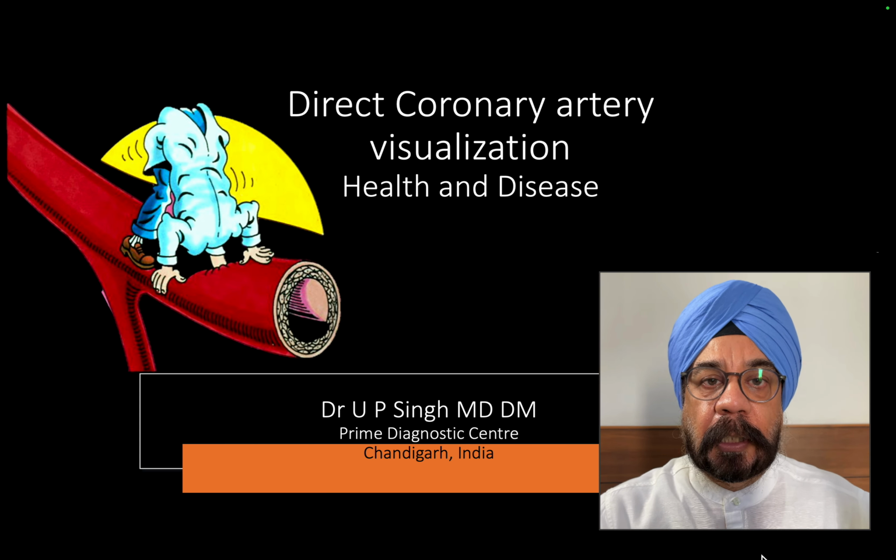Interesting topic on echocardiography: direct visualization of coronary arteries. Direct means that you can see the coronary arteries on echocardiography.